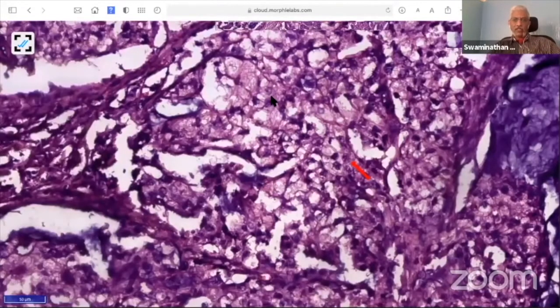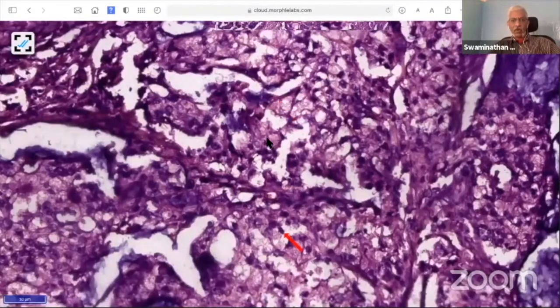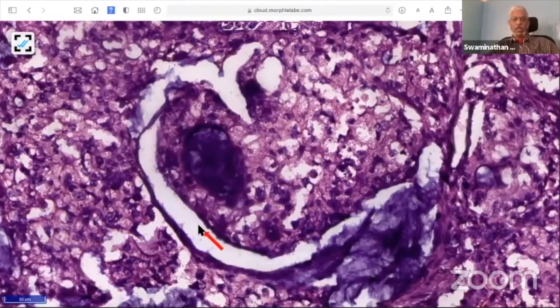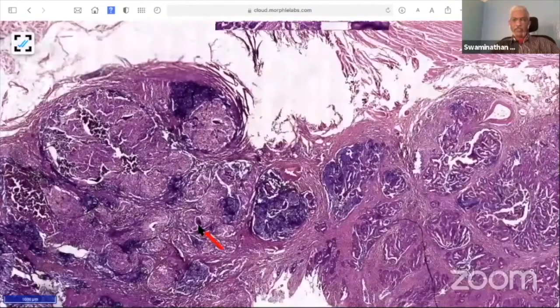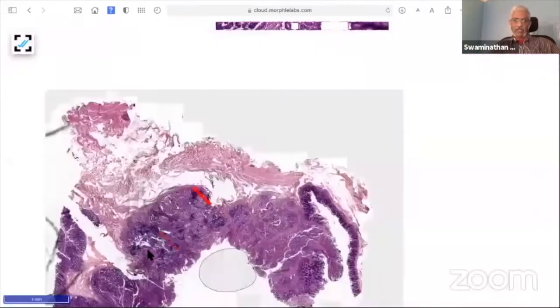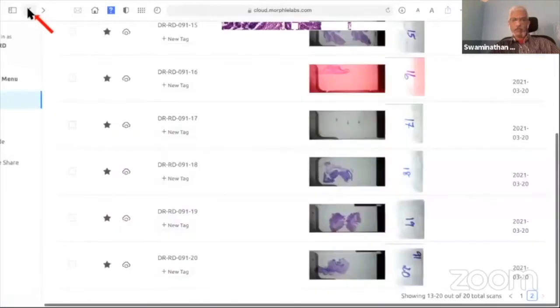And these tumors are very rare. They don't know what the prognostic significance is. In those cases, please say adenocarcinoma NOS with clear cell features. Always quantitate. For example, this is the only area where I see clear cell features. I may call it 40%. So in future, they may examine all these cases, and they may come up with some useful information.